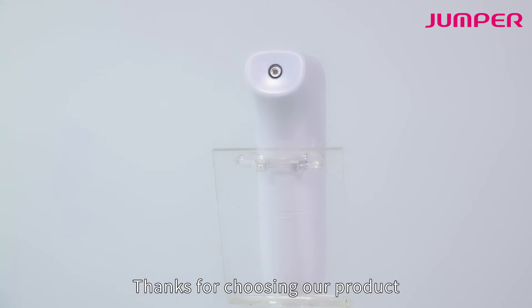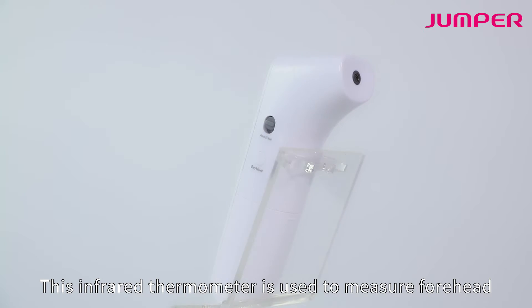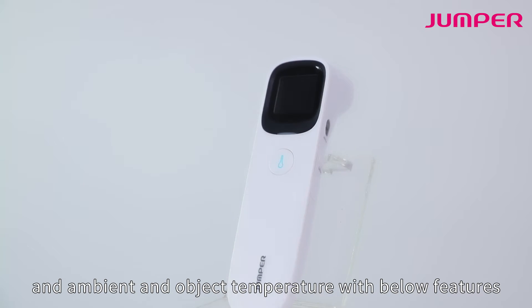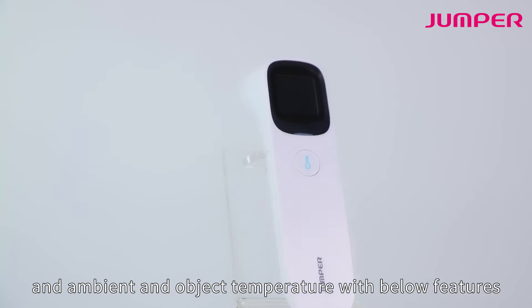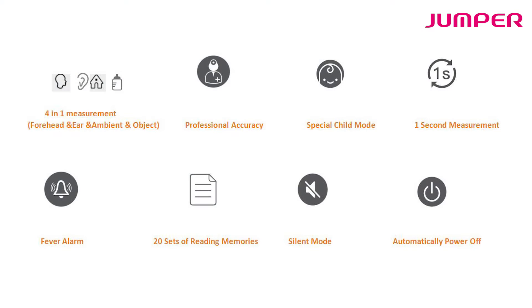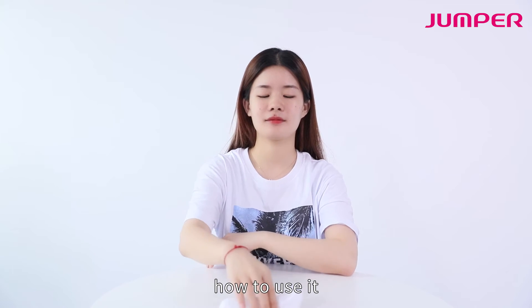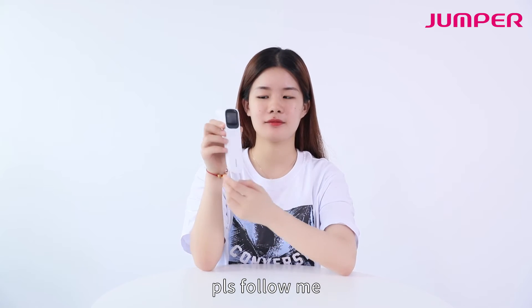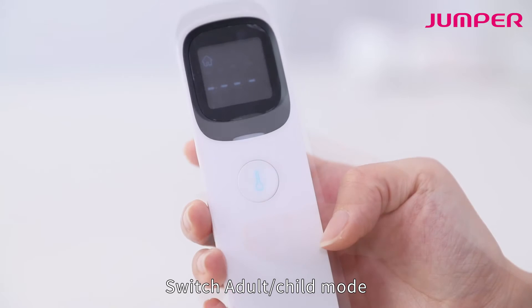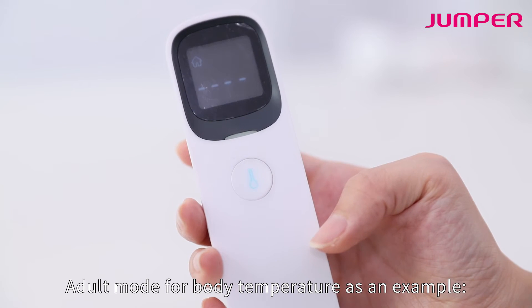Thanks for choosing our product. This infrared thermometer is used to measure forehead, ambient, and object temperature. To use it, turn on the thermometer switch. There are adult and child modes — adult mode is used for body temperature measurements.